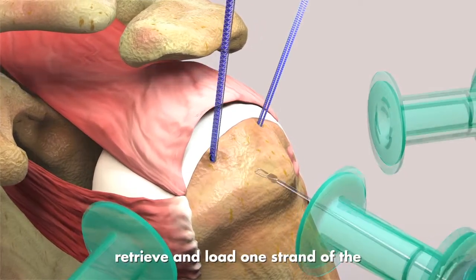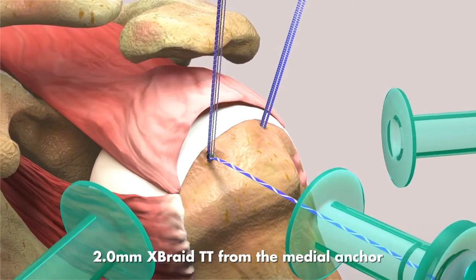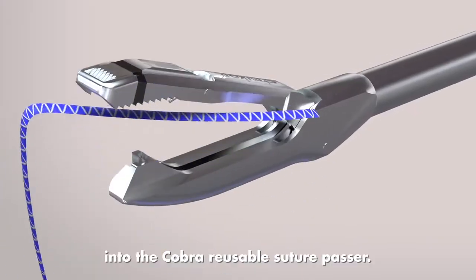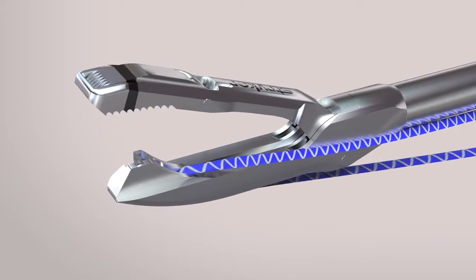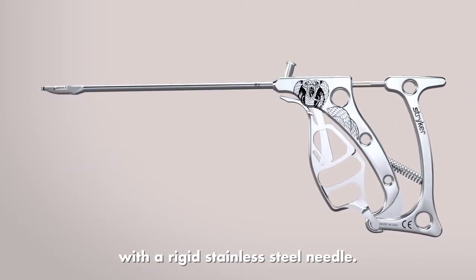Through the lateral portal, retrieve and load one strand of the 2.0mm X-Braid TT from the medial anchor into the COBRA reusable suture passer. COBRA is the first-ever reusable suture passer with a rigid stainless steel needle.